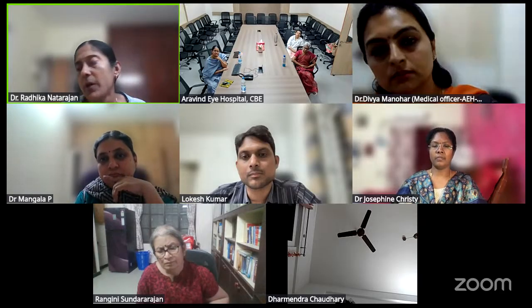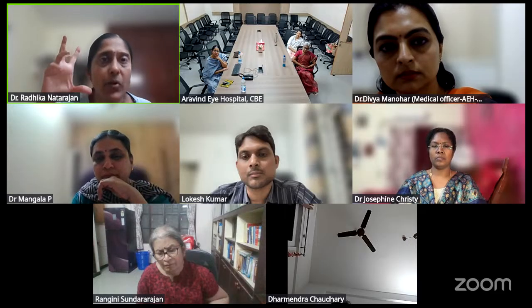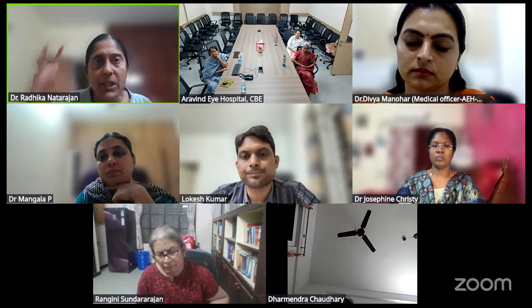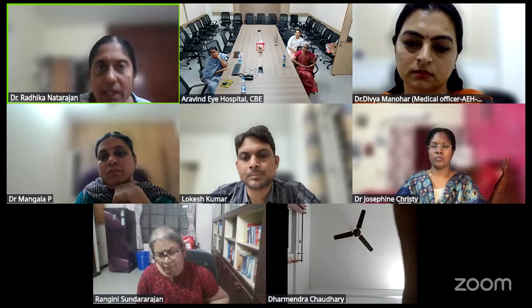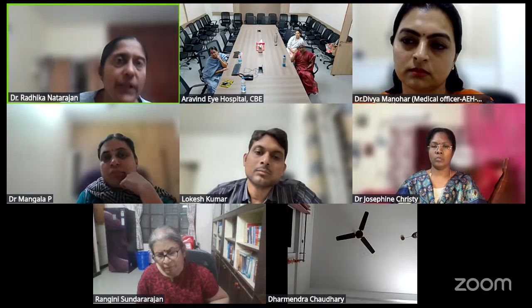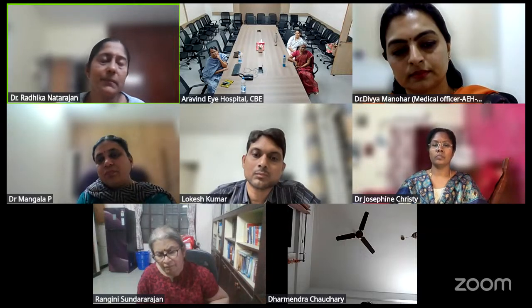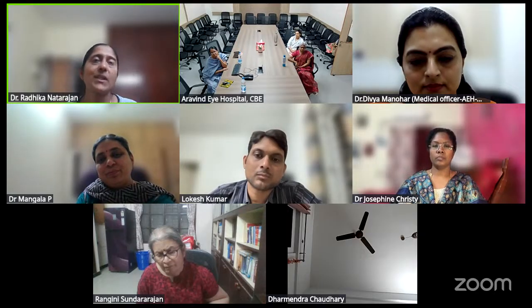But a small word of caution: sometimes for these hydrops, 1,500 micron cornea, which is swollen, the apex may still be very thin. You may have a lot of edema, which is clouding the thinness at the apex. So it is well worth doing an ASOCT to see which is the thinnest point of that bloated cornea, so that you avoid that while taking the compression suture. Otherwise, paradoxically, you may end up perforating the cornea also. So these are my few practical tips on surgery for keratoconus.